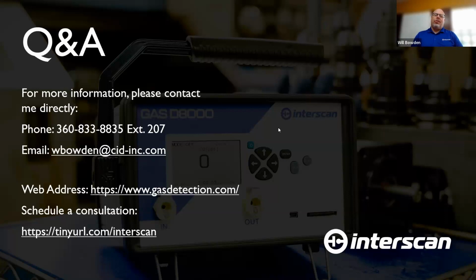In terms of common issues faced with gas detection systems, a lot of times it can be environmental. For example, mist or vapors in the air, temperature, and humidity are other items that come into play in gas detection applications overall and can cause possible issues.